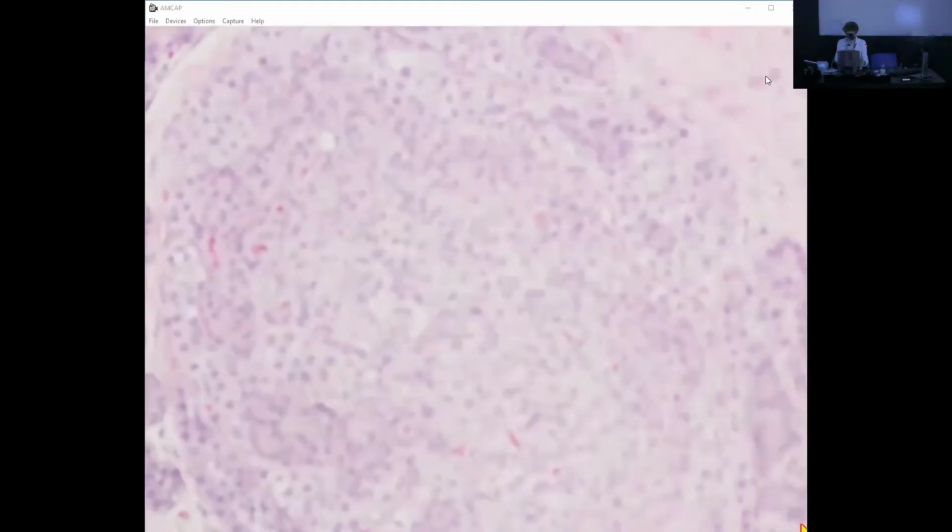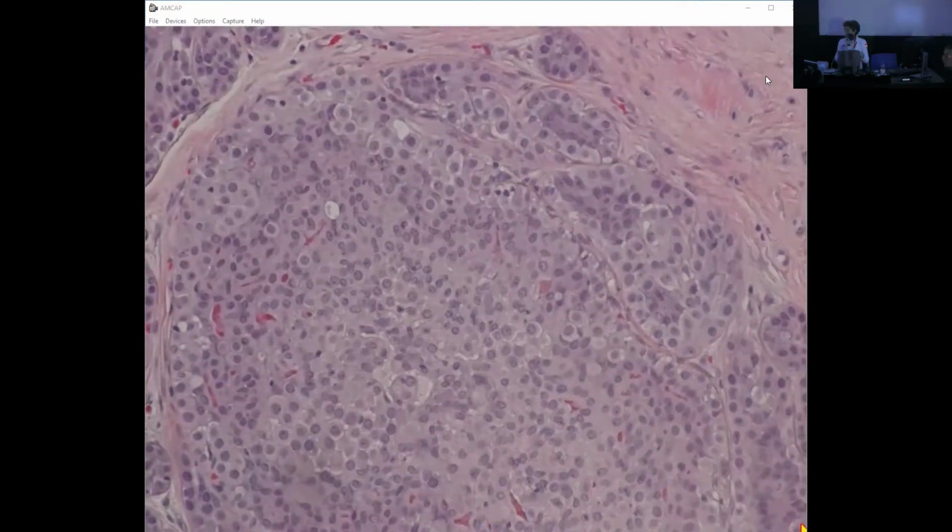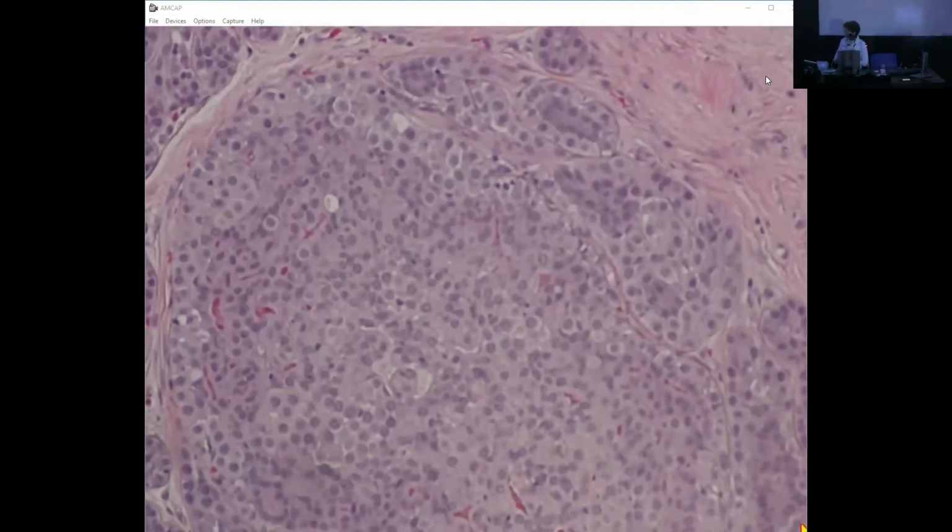There are fried eggs, loads of them, all over the place, right? It's a solid proliferation, right?